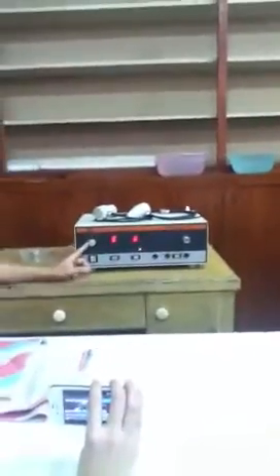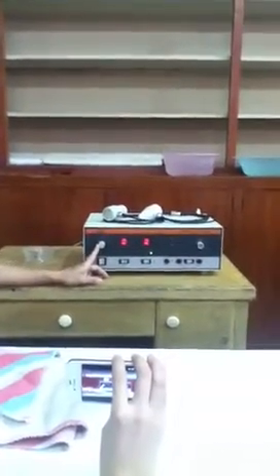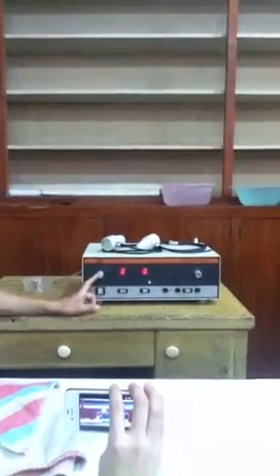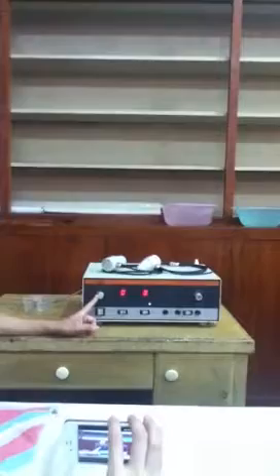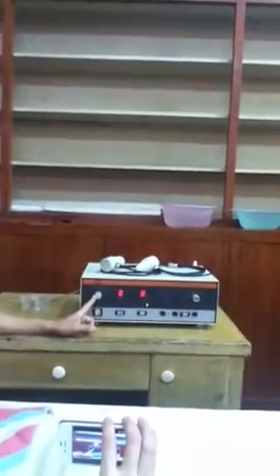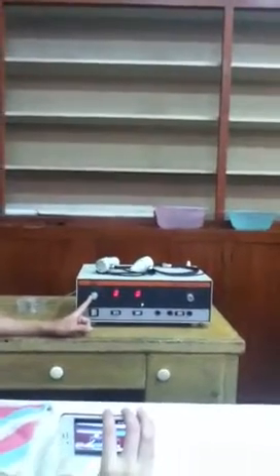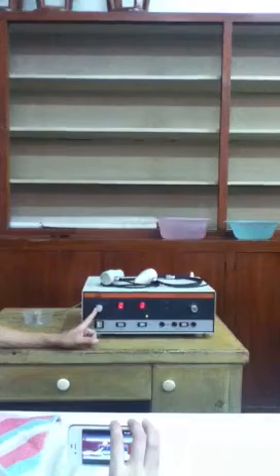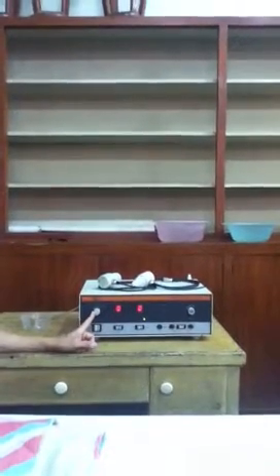Okay, next, this knob here. This is a selector knob used to select which type of ultrasound you're going to use, whether it's pulse or continuous. If it's continuous, it means it's always delivering energy, always on, so there's more thermal effect. More thermal effect, more heating up of the tissue.